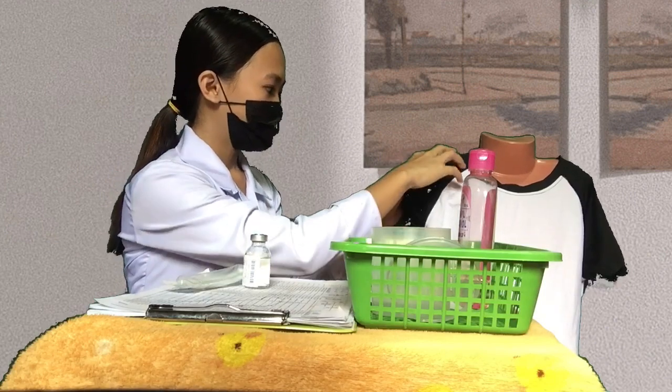And then next is I'm going to wash my hands. I'm going to disinfect my hands to prevent contamination, and then leave the patient in a comfortable position. Okay. Then next is I'm going to document the procedure done for baseline data. And then after that, I'm going to observe for any adverse reactions or any untoward outcomes. And I will notify the physician if there are any. And that would be all for this procedure.